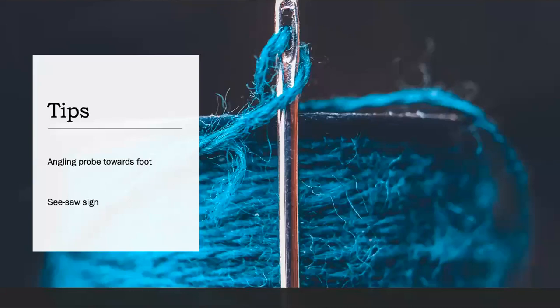Just some tips and tricks. It can sometimes be difficult to visualize the nerves. Angling the probe towards the foot sometimes helps, because the nerve doesn't run parallel to the skin, so the probe doesn't always catch it perpendicularly — by angling towards the foot you can improve scanning due to the anisotropy of the nerve. The seesaw sign is also used to better visualize the nerves. This is achieved by either active or passive dorsiflexion and plantar flexion of the foot to make the nerves dance, producing a seesaw pattern.